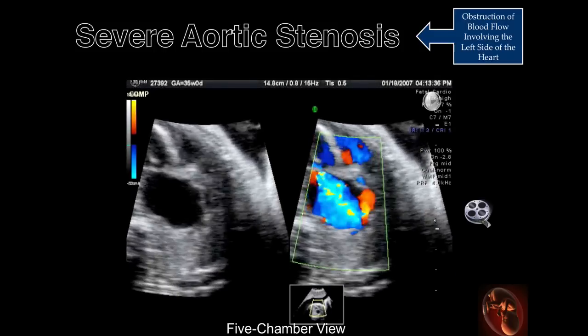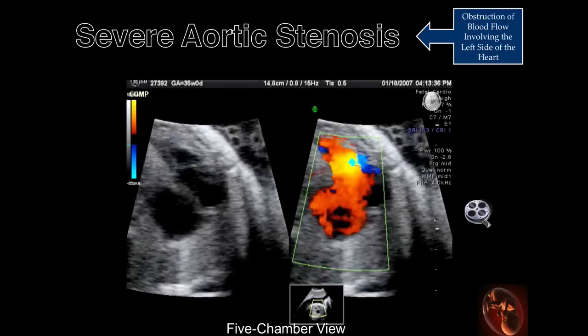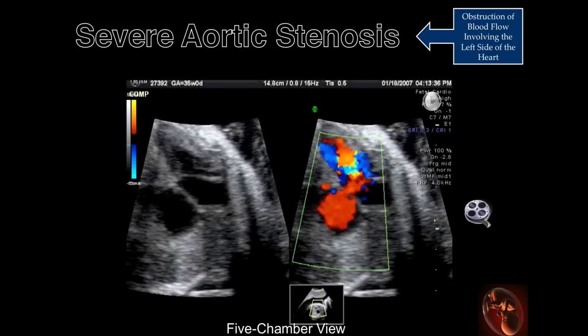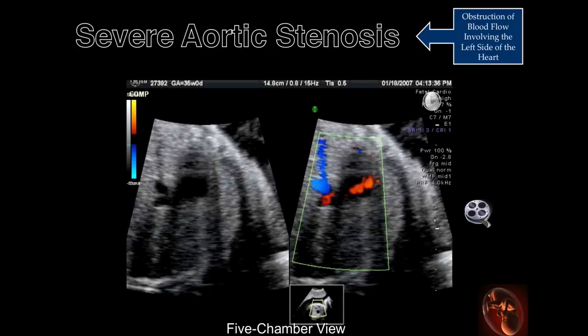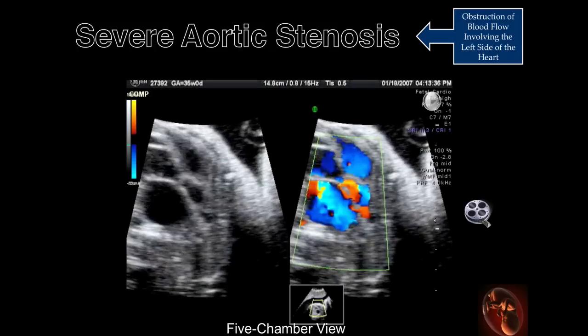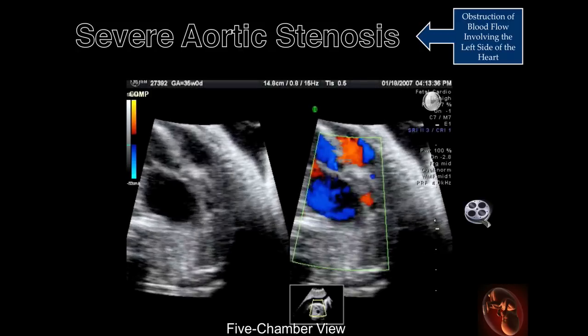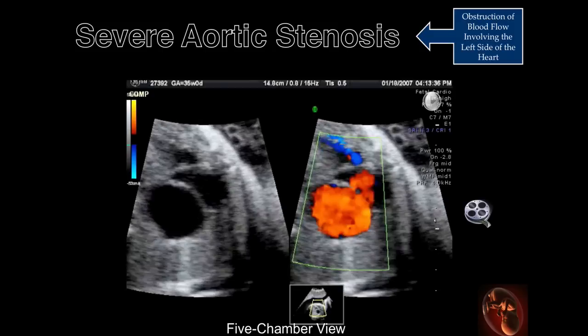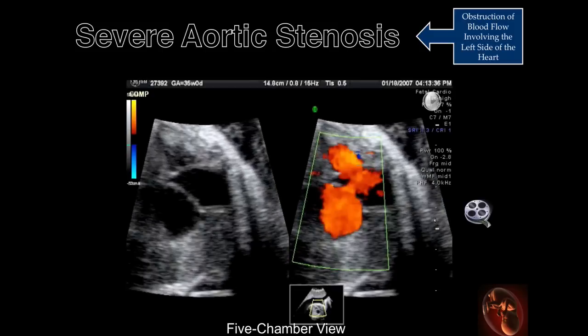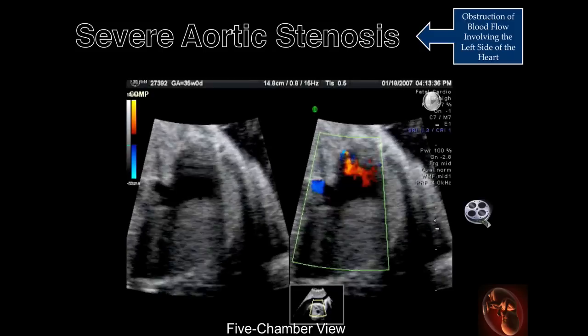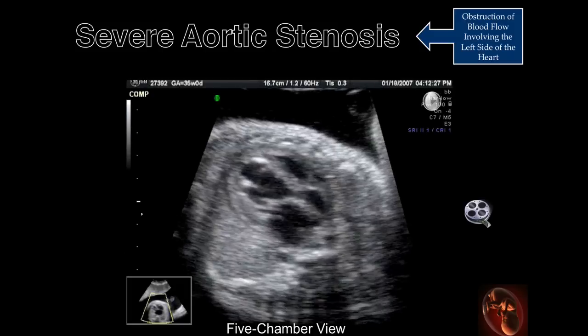When the color Doppler is activated, notice the changes described in the previous slides that include abnormal flow distal to the aortic valve, significant mitral regurgitation, and flow from the left to the right atrium.